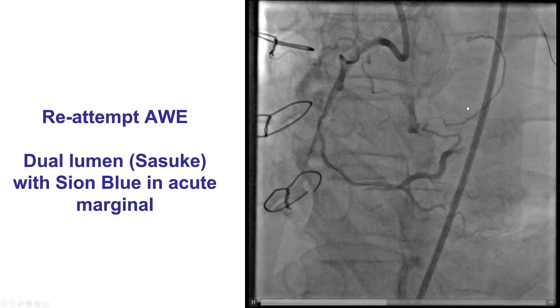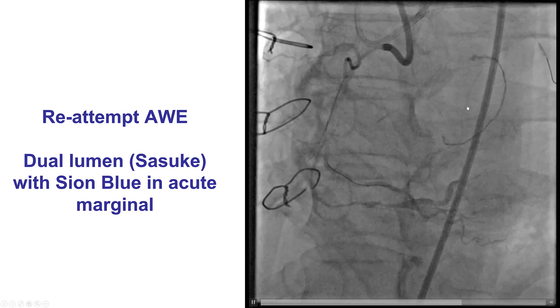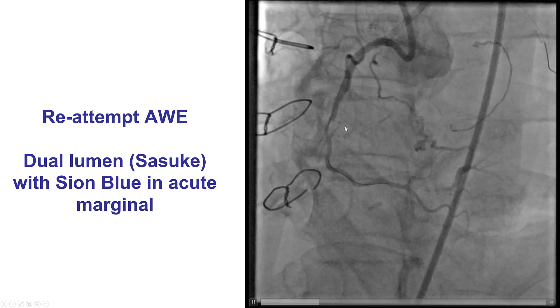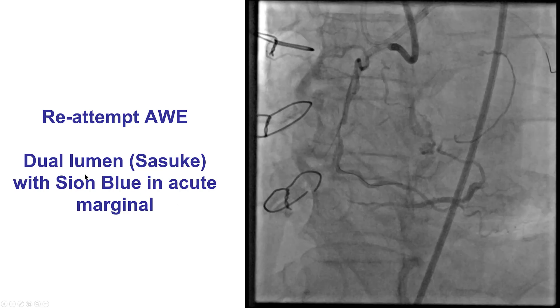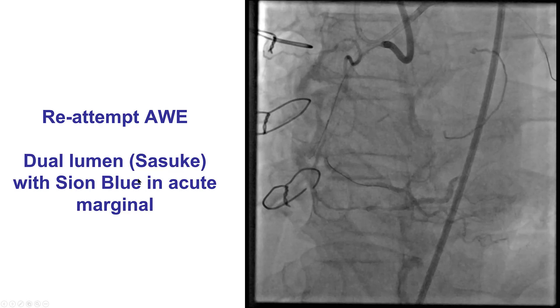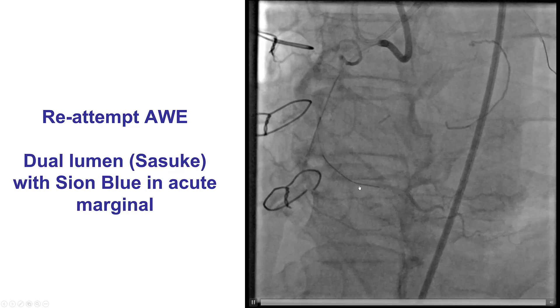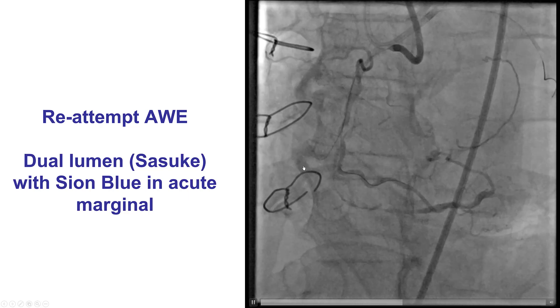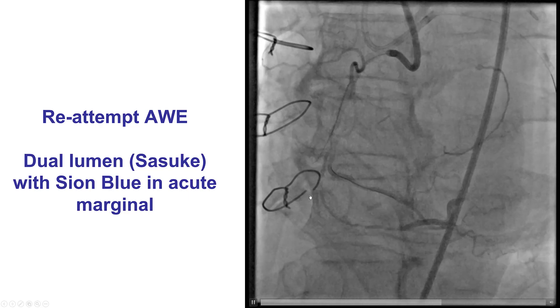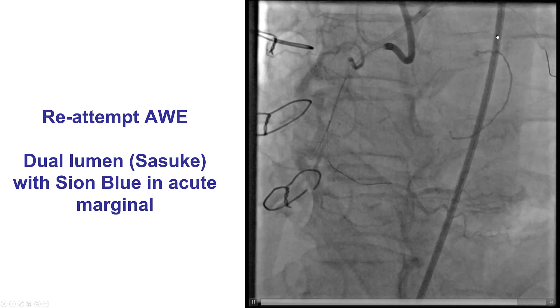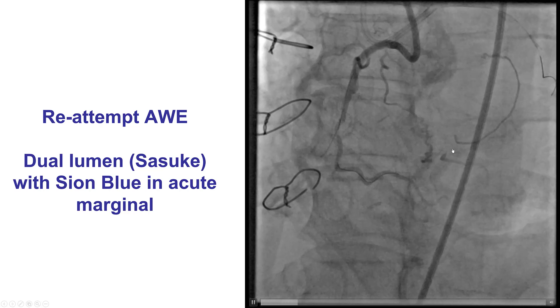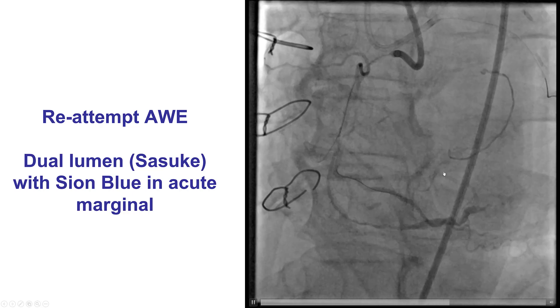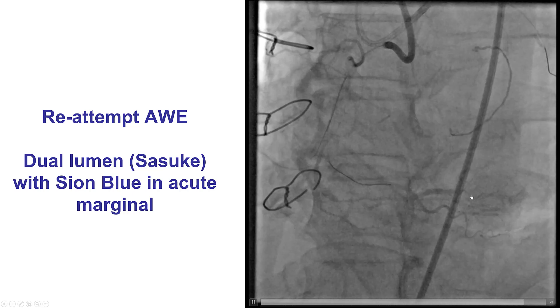We tried briefly antegrade, but that was unsuccessful, and we decided to try crossing using a dual-lumen microcatheter — a Sasuke — having a Sion Blue workhorse wire into the acute marginal. But once again, the wire is not moving in the course of the vessel. You can also appreciate the tortuosity of the ipsilateral collateral supplying the right posterolateral.